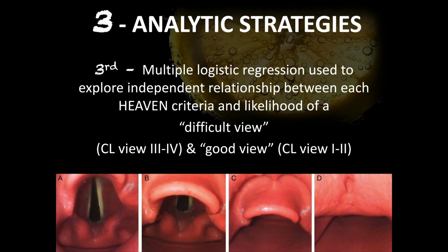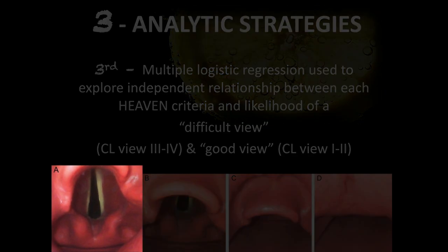So this is a great picture here, guys, that really depicts what we all have been taught when we were using just our DL approach, standard laryngoscopes. We always try to focus on that view on the far left, that A view, that's Cormack-Lehane 1. But if you've trained with a video laryngoscope, you know that it's very, very easy. You have a camera at the distal tip of that laryngoscope, and it is zooming in on your structures.